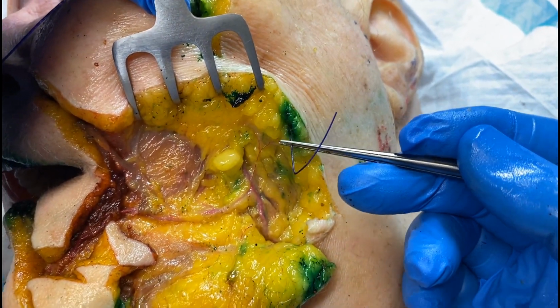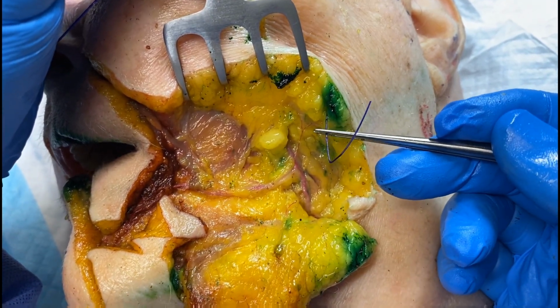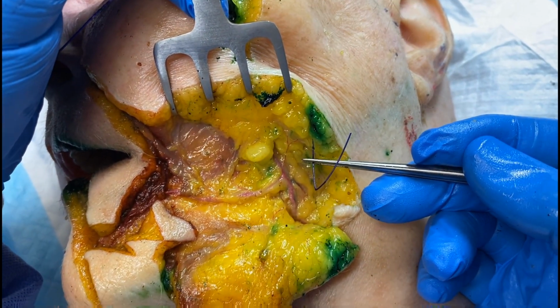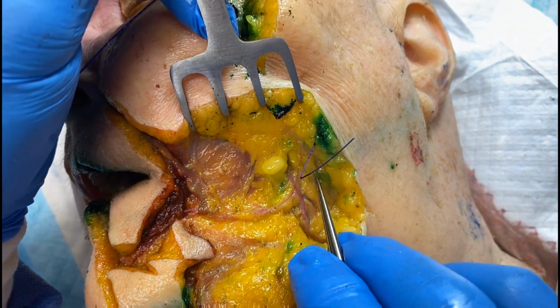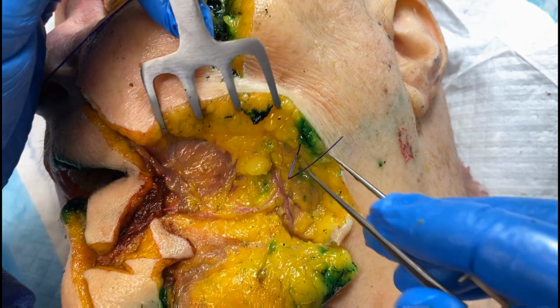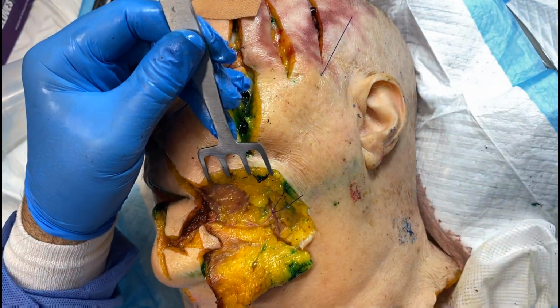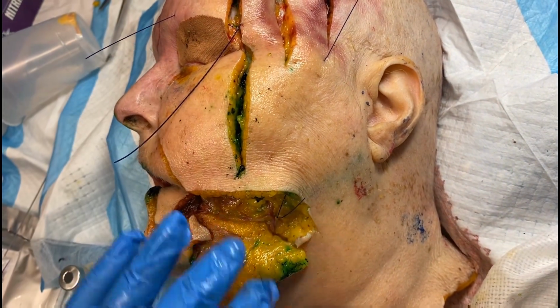So that is really placed in a perfect plane, and that's what you're looking for, and that's what you're trying to get to and achieve to really get the best lift. And you also have to use the strongest threads for sure, but that is where you've got to get to. So that's a really unique view for you to be able to really go ahead and see that.